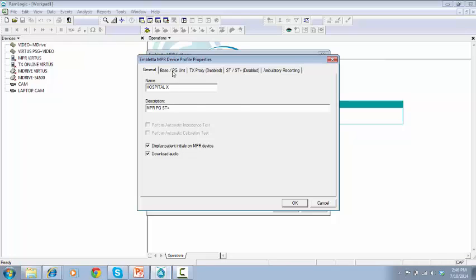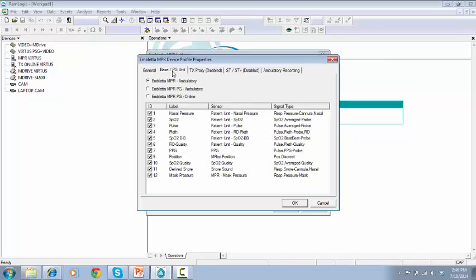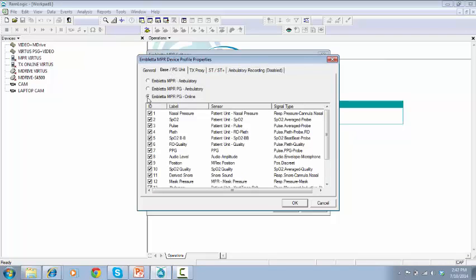On tab Base PG Unit, select your preferred recording mode. In this case, we'll choose Embletta MPR PG Online. Tick or untick the boxes below according to your requirements.